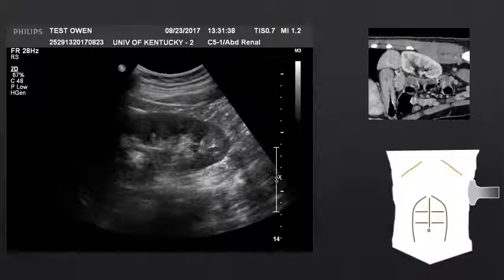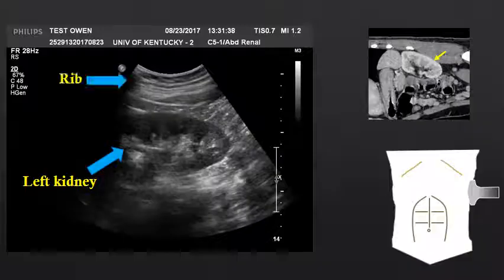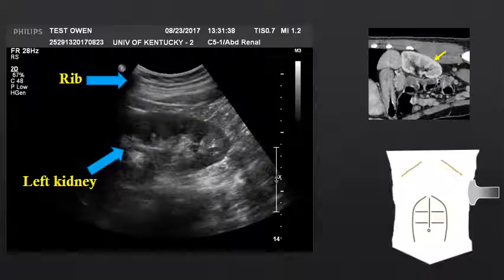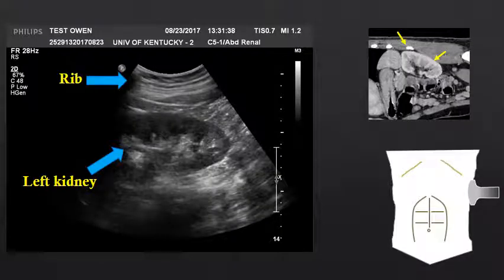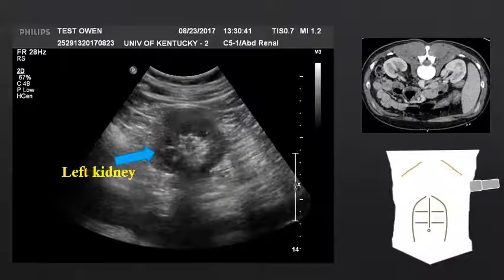If we look at a long axis view of the left kidney, we see the central echogenic fat and the peripheral hypoechoic cortex. The left kidney sits slightly higher than the right kidney, and often ribs in the chest wall can result in shadowing that may obscure portions of the left kidney or make it difficult to identify. In a transverse view, we again see the central echogenic renal sinus fat and the peripheral hypoechoic cortex.